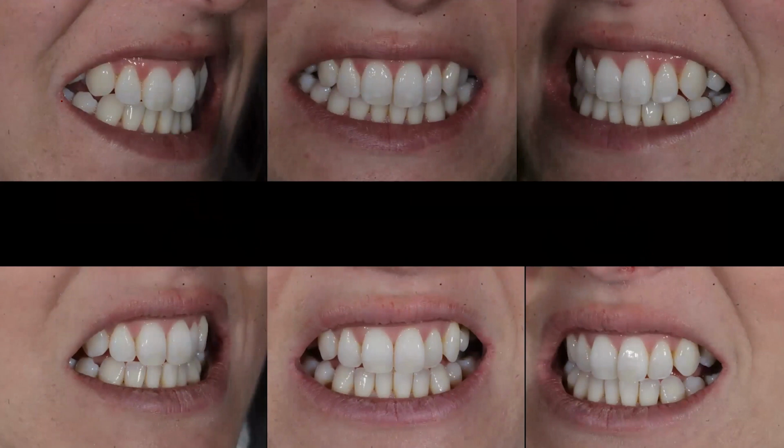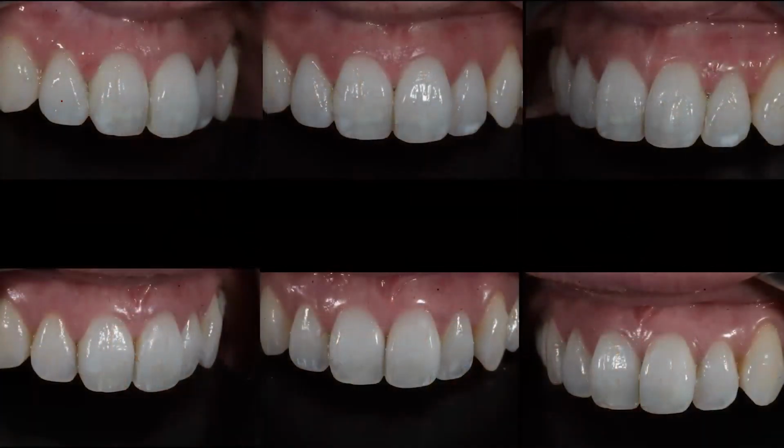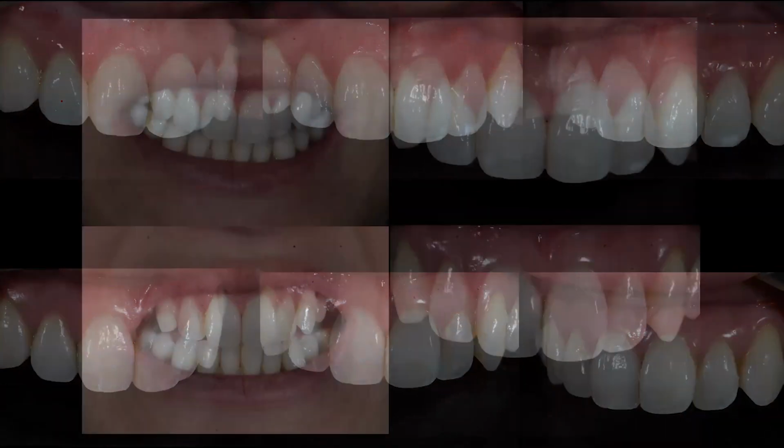And so for these sort of white spots, it can be beneficial. Perhaps if I'd done a few more applications or been a bit more patient with it, we could have maybe done it purely with Icon. But I think sometimes when they're really defined, those white spots, you have to do a little bit more than you may bargain for. But ultimately, it's still quite a minimally invasive treatment. Taking off a few microns to improve the appearance of the teeth is okay, and I'd be okay with that on my teeth if I had spots that bothered me this much.